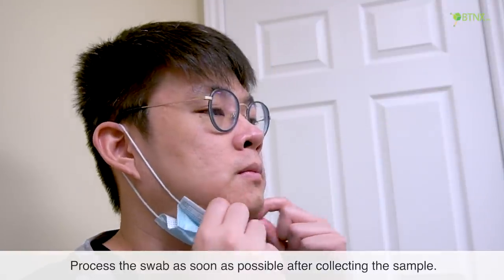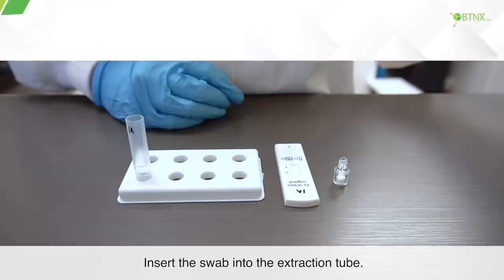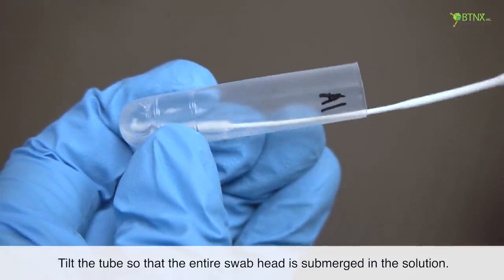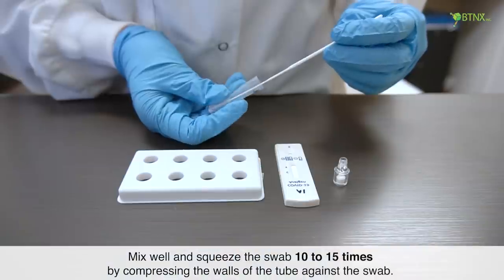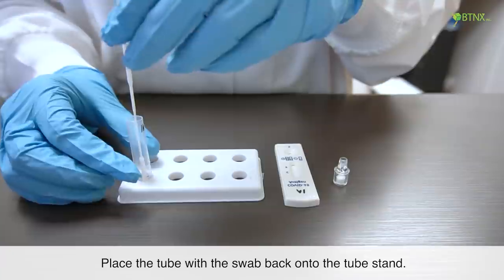Process the swab as soon as possible after collecting the sample. Insert the swab into the extraction tube. Tilt the tube so that the entire swab head is submerged in the solution. Mix well and squeeze the swab 10 to 15 times by compressing the walls of the tube against the swab. Place the tube with the swab back onto the tube stand.